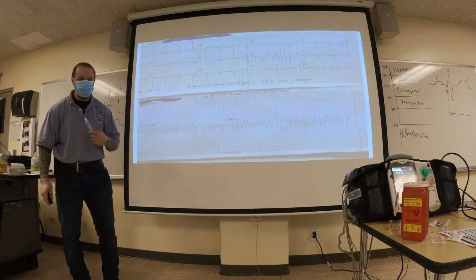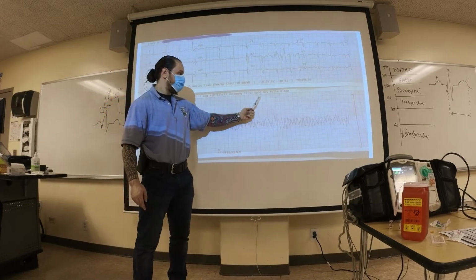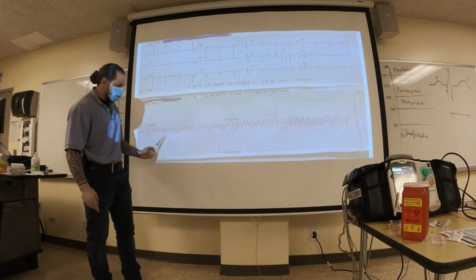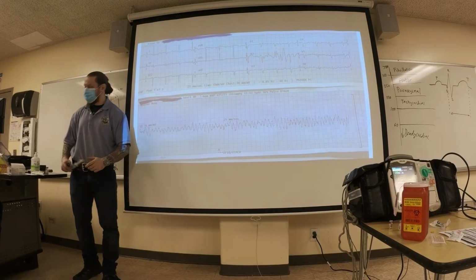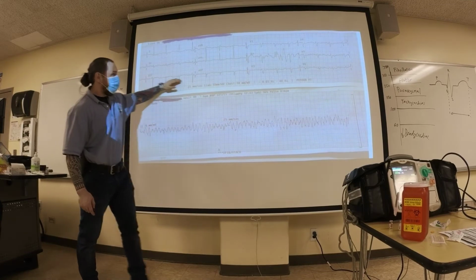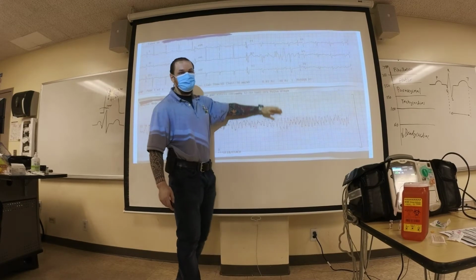This is a case I had. I don't know if you guys can see. Can you see the vital signs? 121/73. Pulse ox 96. And it gives you the correct heart rate. So the monitor is going to start beeping, V-fib, V-tach. And this was torsades. This guy was alert and oriented times 3, no complaints at all. And so he got mag. And you see with the 12 lead, you see still, it still did not fully resolve, but it's definitely better than this. You know how this may happen with you guys?